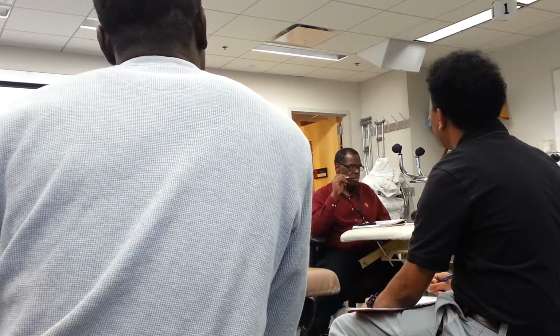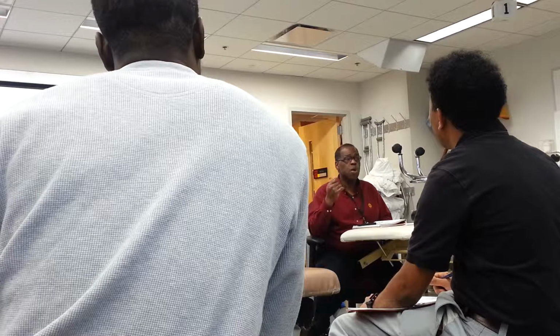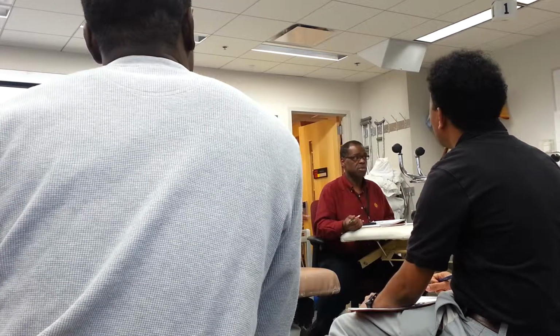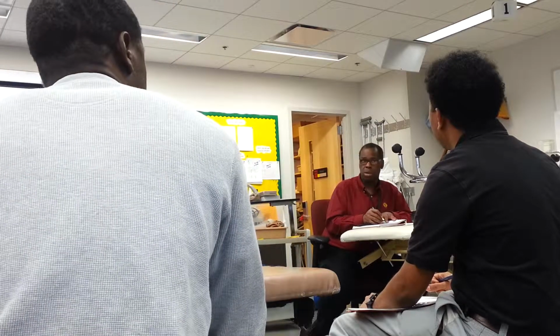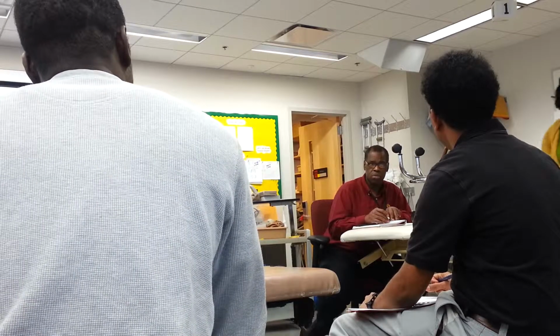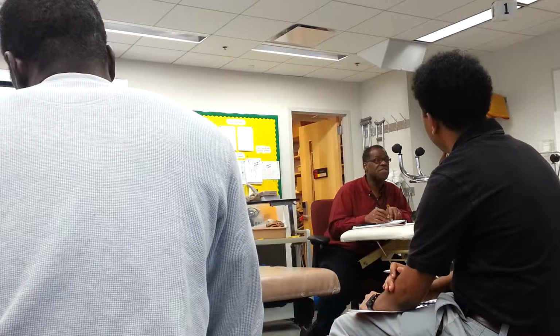If I set it on a pulse rate of 100 and a pulse width of 200, I'm also going to get what though? Twitch, motion, movement. All right, now I don't want that with acute pain. So with acute pain, I want a pulse rate of 100 and I want a pulse width of 50.